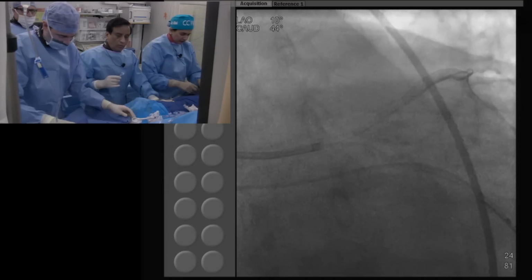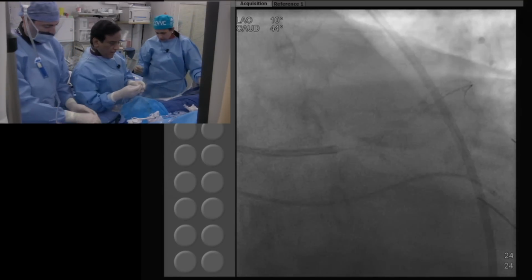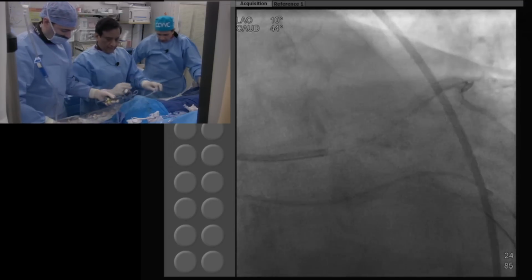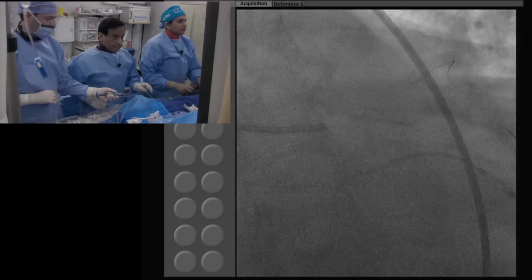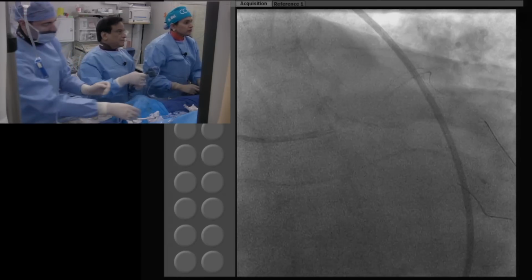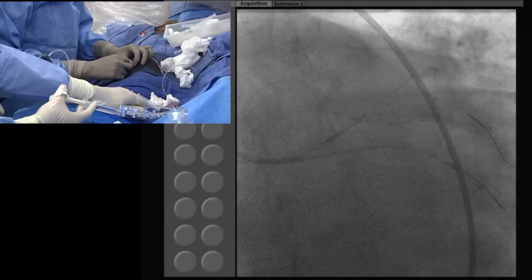And we are going to show that this aneurysm is going to almost disappear after stenting. I'm not that confident. Go. I think using Synergy the aneurysm will decrease, but let's see if it decreases substantially. Samin, you want to? Okay, let's go.